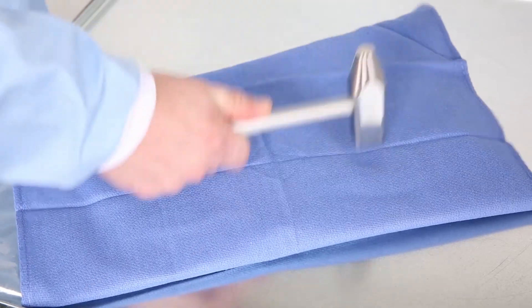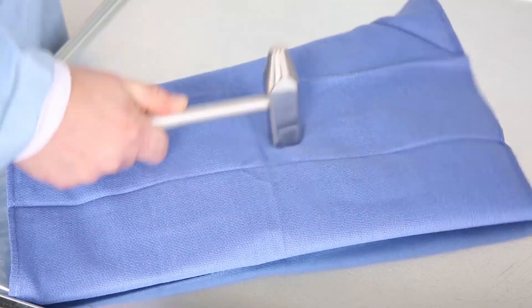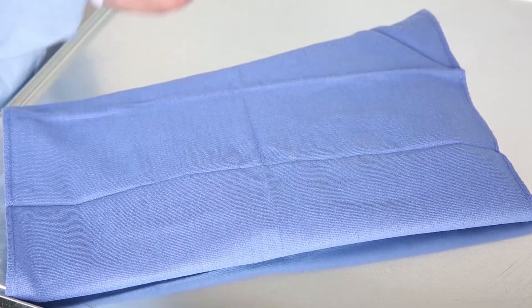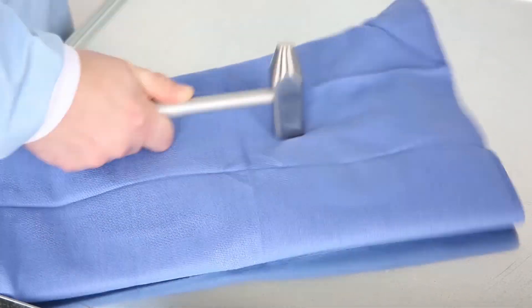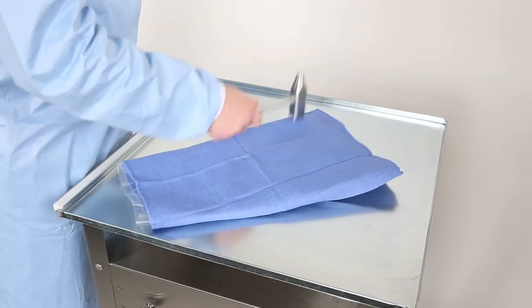In manipulating the frozen solution, care must be taken to avoid the use of small and/or sharp instruments that may perforate or otherwise damage the sterile barrier pouch and the solution bag.